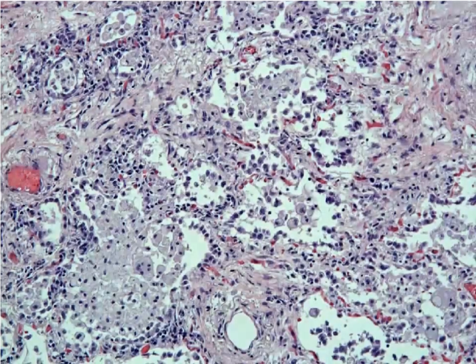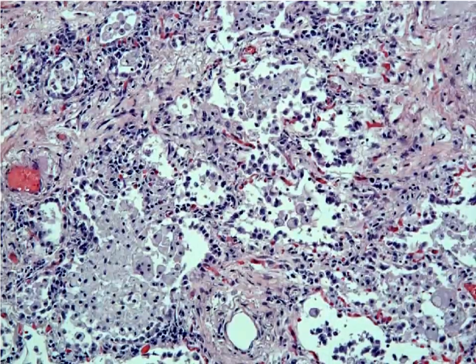So as we've discussed in class and through email, acute and chronic inflammation can often happen at the same time. And this is a great example of a case in which that happened. So this was an autopsy that we did last year. And this is a section of the lung.